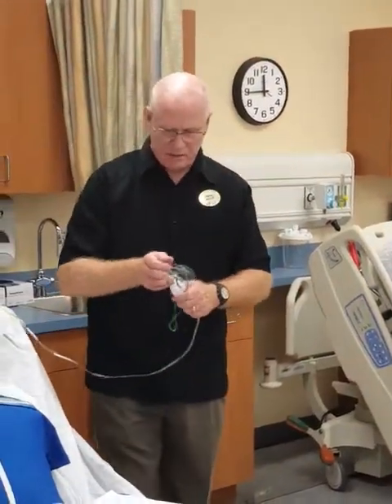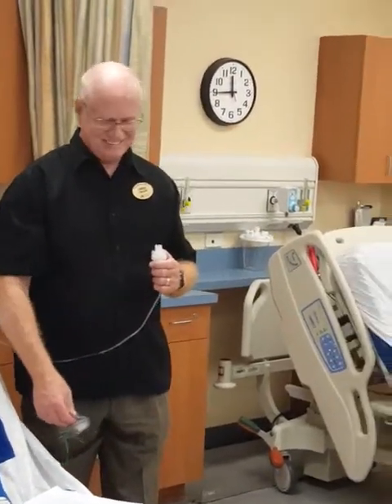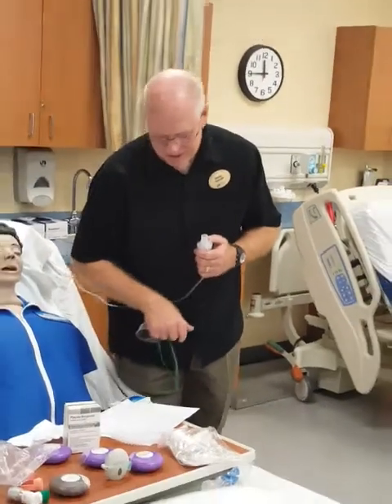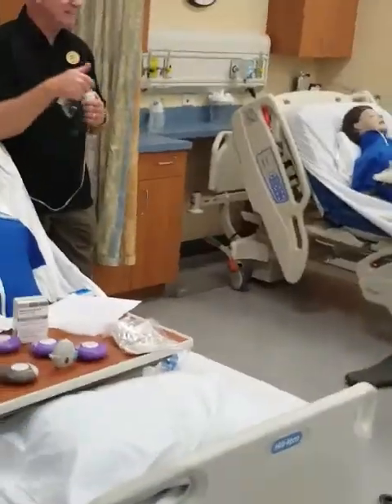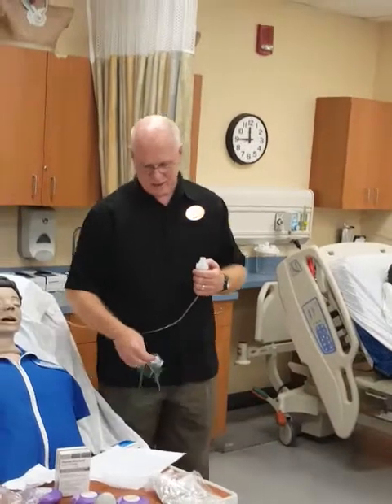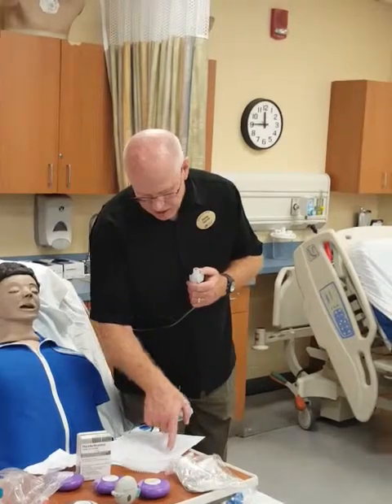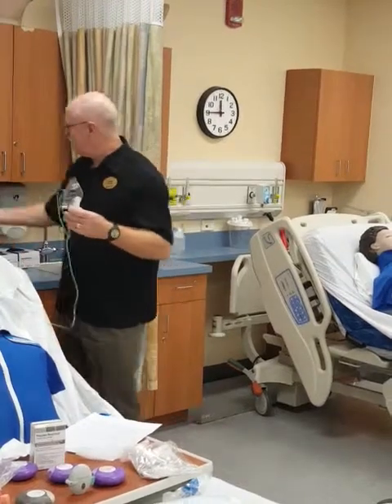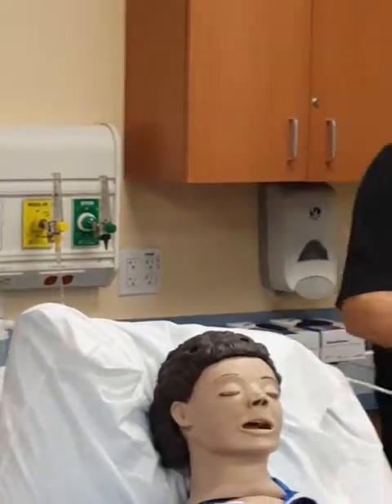We're going to put this back on. You definitely would want to get a new mask or clean up — there's no telling how much bacteria is on the floor in a hospital, everybody walking in and out from patient to patient. So aseptically, place the medication in. Set the gas flow to six to eight liters, and you have yourself a nice aerosol.